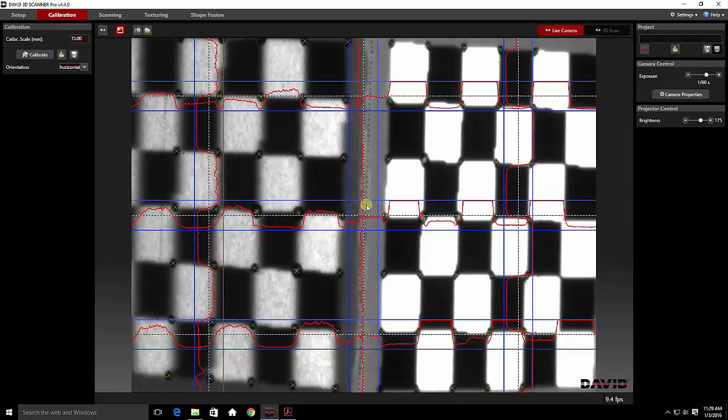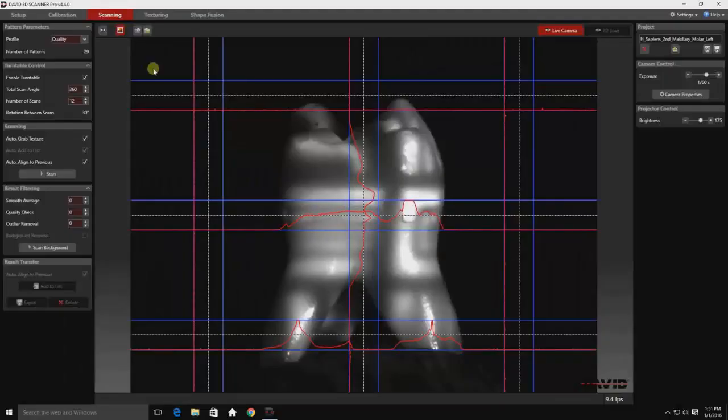Now that we have a good solid calibration, we know that this setup works. We want to save it. Here you can see our tooth is pre-centered in the frame, and I'll be moving through the proper setup and exposure settings for the image.